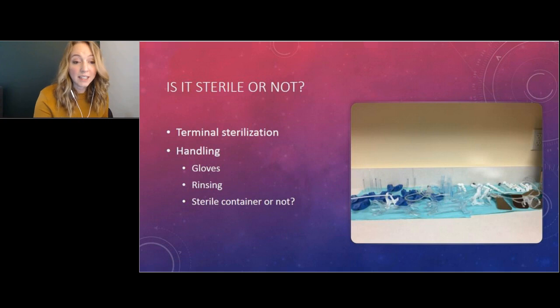So again, related to this, to clarify, the main difference between HLD and cold chemical sterilization is the type of chemicals used and the exposure time frame that's required. It is my understanding that HLD cannot kill spores, but can you explain why dental offices might use chemicals that require longer soak times, especially when they have such high pressure to turn over instruments quickly? This is kind of the bane of my existence, I think.